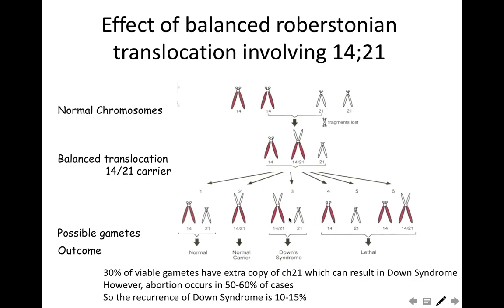إذا نتوقع إن this female did a karyotype analysis because she may have had a Down syndrome baby and the Down syndrome was of translocation type. فبالتالي عايزين نعرف if she is a carrier of translocation type then she may get another child which will be also Down.